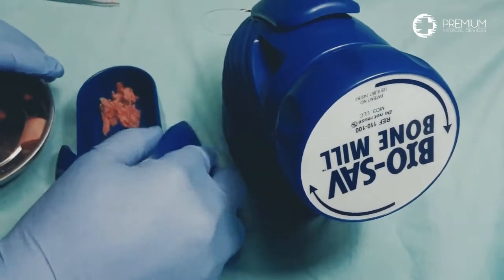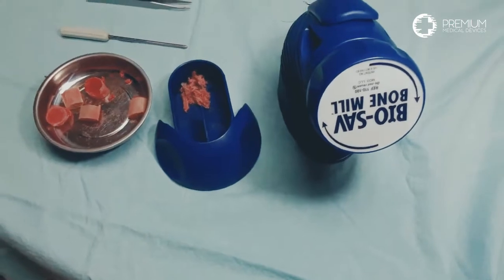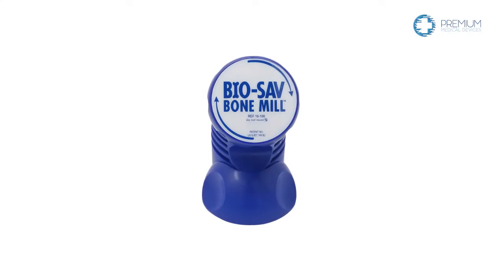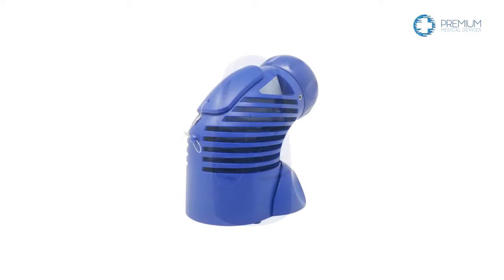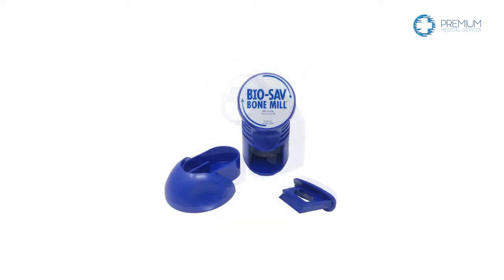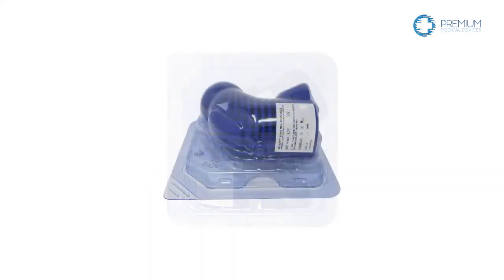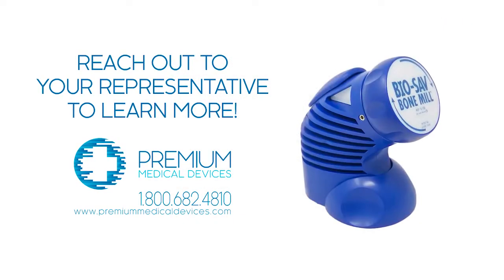Please notice how much smaller the second pass reduces the bone. This is a highly reproducible process to size-control bone to a surgeon's preference — a very unique proposition versus the competition. In closing, this procedure took 90 seconds to mill bone to a desired size. It is the most reproducible and easy-to-use bone mill available. I hope you enjoyed this video, and if there are any questions, reach out to your representative to learn more.